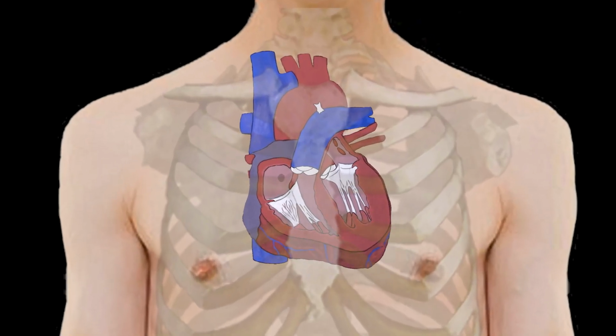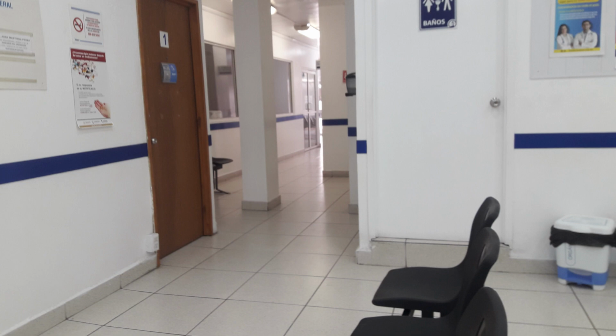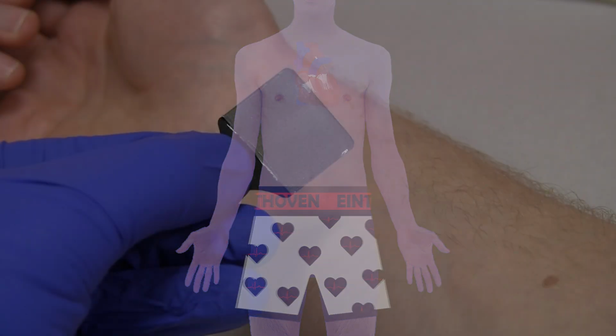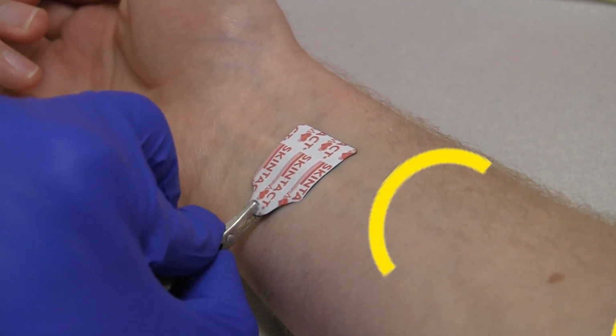Because the heart sits deep in the chest, placing electrodes directly into the heart tends to be unpopular with patients. We need a way to indirectly measure heart depolarization. Because the body is full of water that contains salt, your body fluids are able to conduct electricity. This means that every time the heart depolarizes, it generates an electric field that ripples through the body fluids. The skin electrodes have a conductive gel that seeps into pores and sweat glands on the skin. This gives the electrode contact with the inner body fluids.